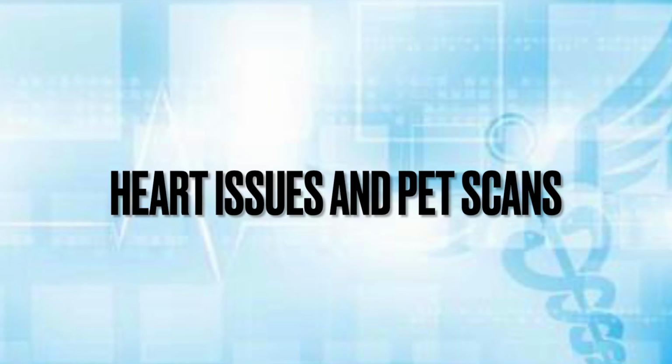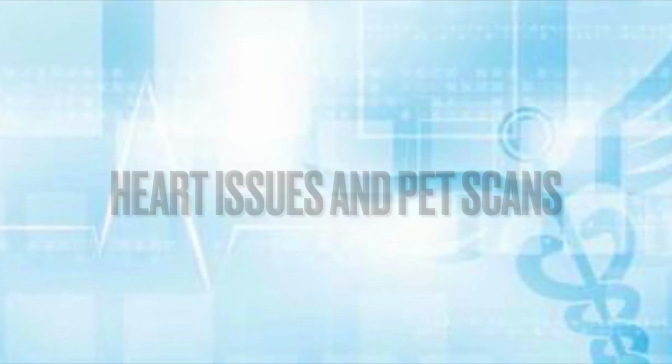If you have already been diagnosed with cancer, doctors may use a PET scan to determine if the cancer has spread or reoccurred, if the treatment is working or not, or to evaluate the diagnosis. If you're having heart problems, doctors may also use PET scans to determine the effects of a heart attack or areas on the heart, or determine the areas of a heart that would benefit from having surgery.